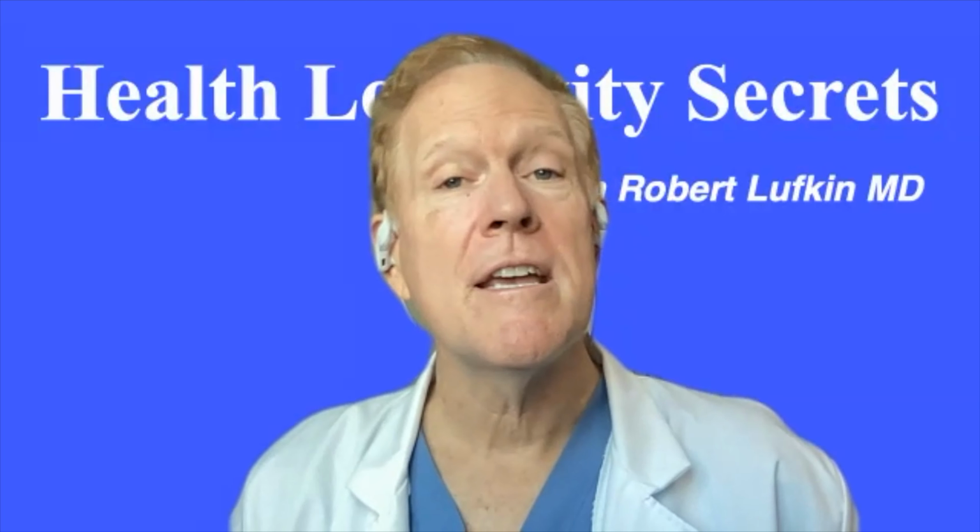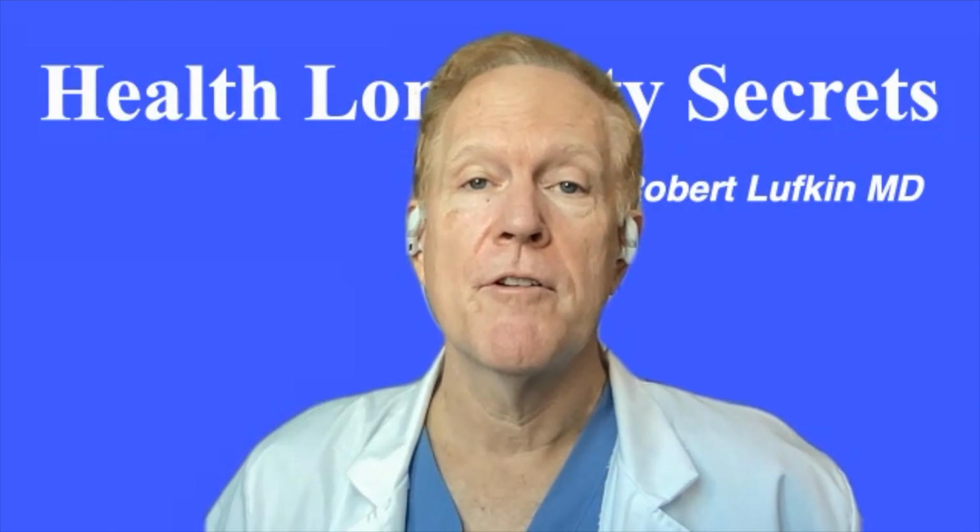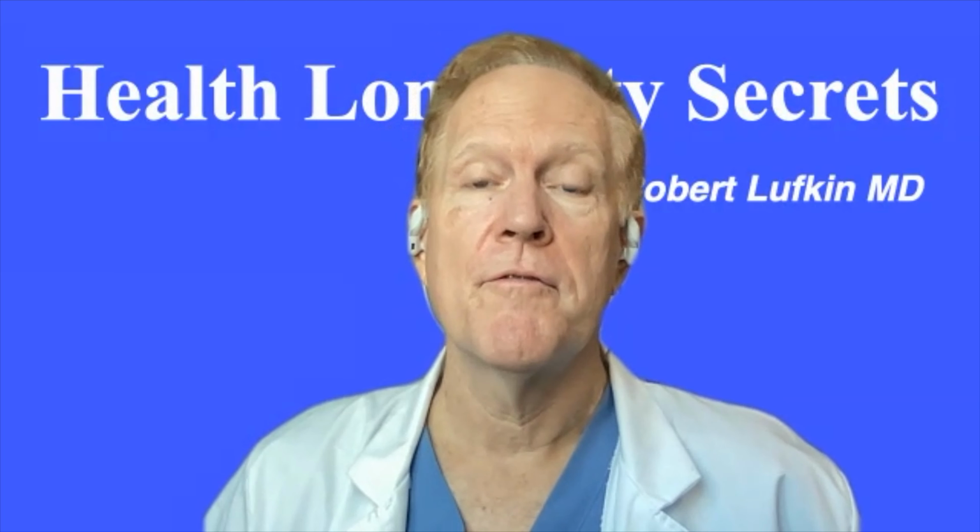Of course, you can use the same technology going into small muscles, which we typically do in neuromuscular disorders, but that's a whole different type of sequence, which takes much longer, and it's more for specialists, like clinical trials, etc. Yeah, so the key areas really would be the abdomen for your visceral fat and subcutaneous fat, and of course the key structure of the liver.